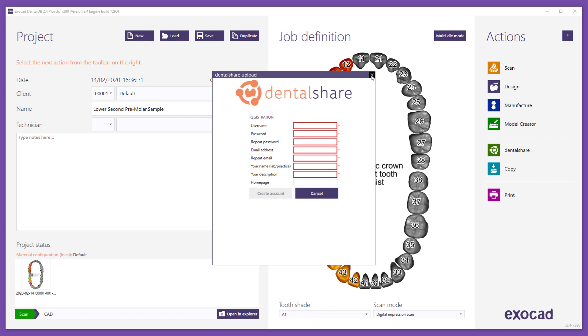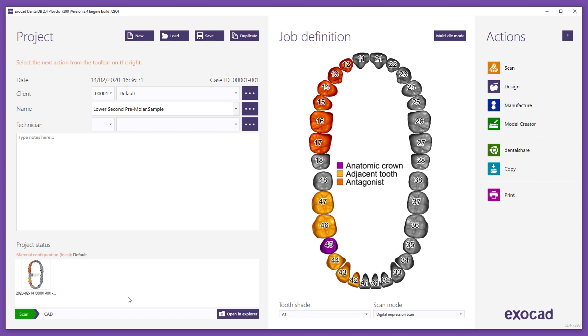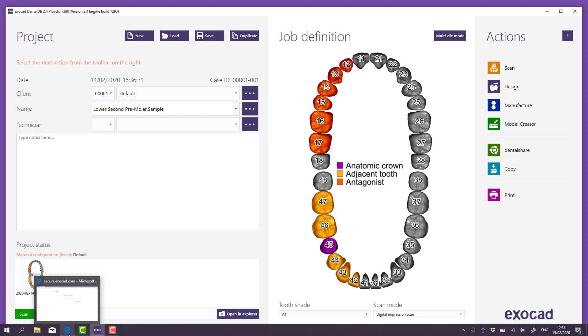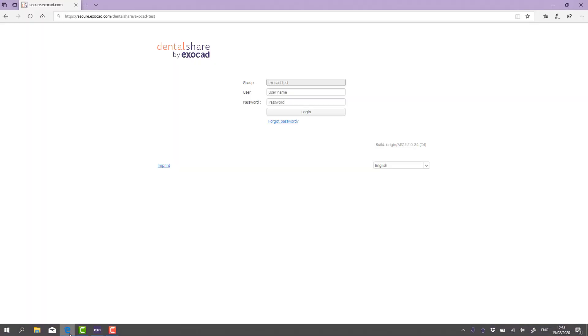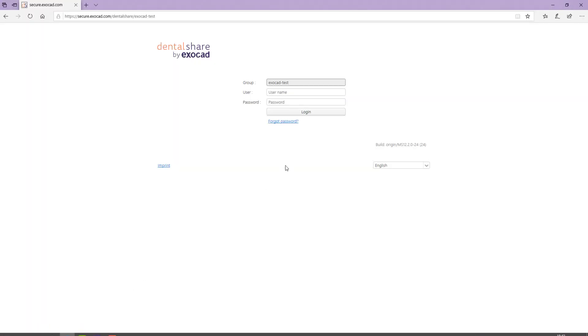DentalShare automatically sends a confirmation email to the entered email address containing a confirmation link and the login information. Click the link in the confirmation email to open the DentalShare login web page.